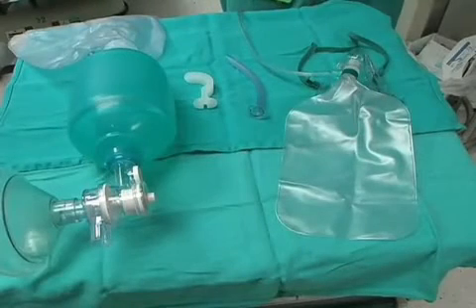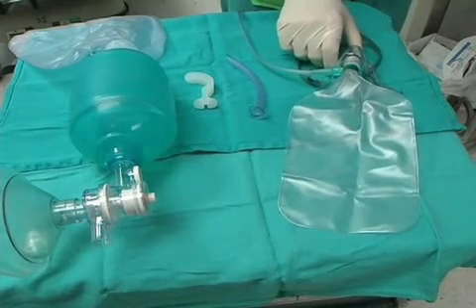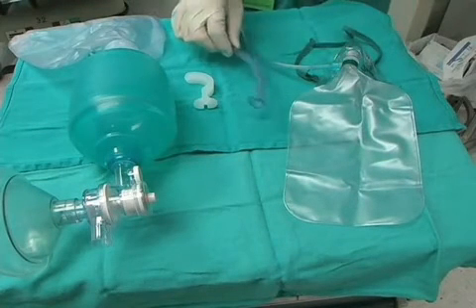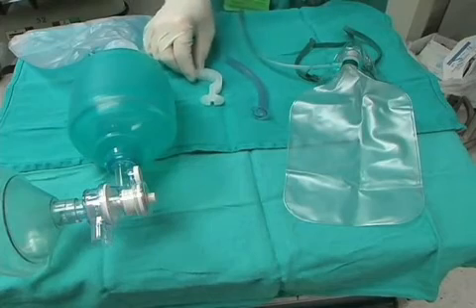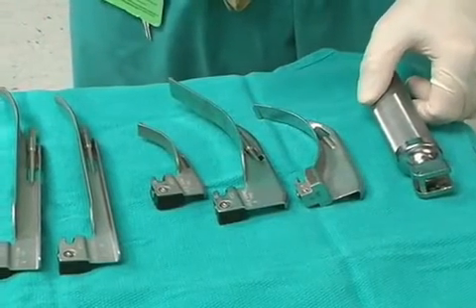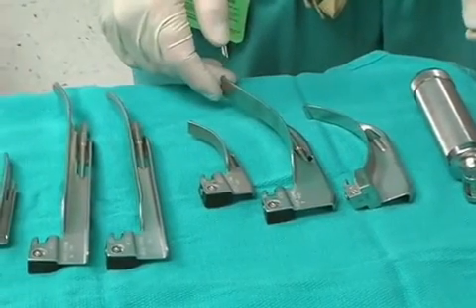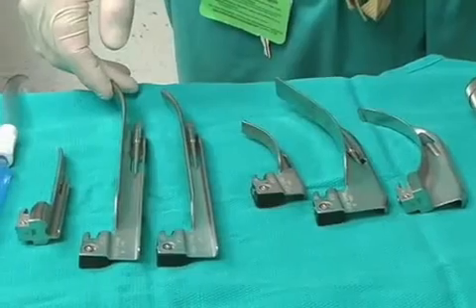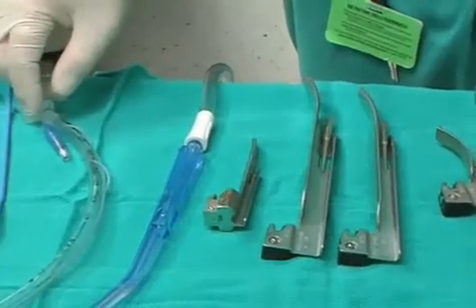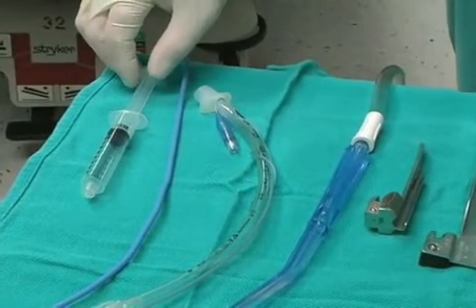Equipment should be accessible when needed. Equipment shown here includes pre-oxygenation equipment such as a non-rebreather mask, a nasal airway, an oral airway, and a bag valve mask device. Equipment for the actual intubation procedure is shown here, including a laryngoscope handle, several sizes of curved blades, several sizes of straight blades, the Yankauer suction, the endotracheal tube, a flexible wire stylet, and the syringe to inflate the cuff of the tube.